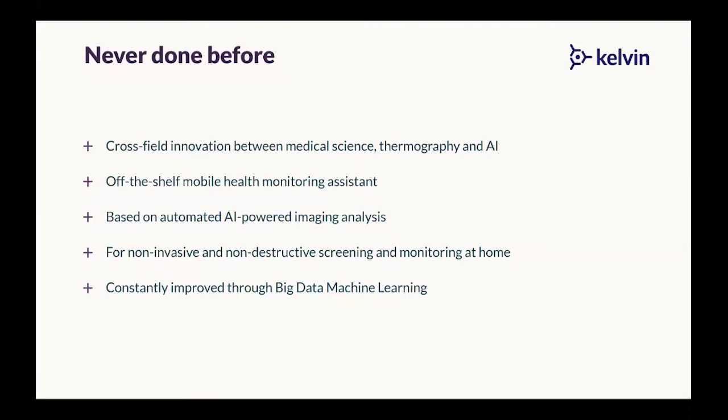So just to give you a glance here, you can see how different parts of my face currently have different body temperature. In a real world environment, I need to be at home and to be shirtless and take a photo of all my upper body from the abdomen up to the forehead. Obviously, I'm not going to do this right now.